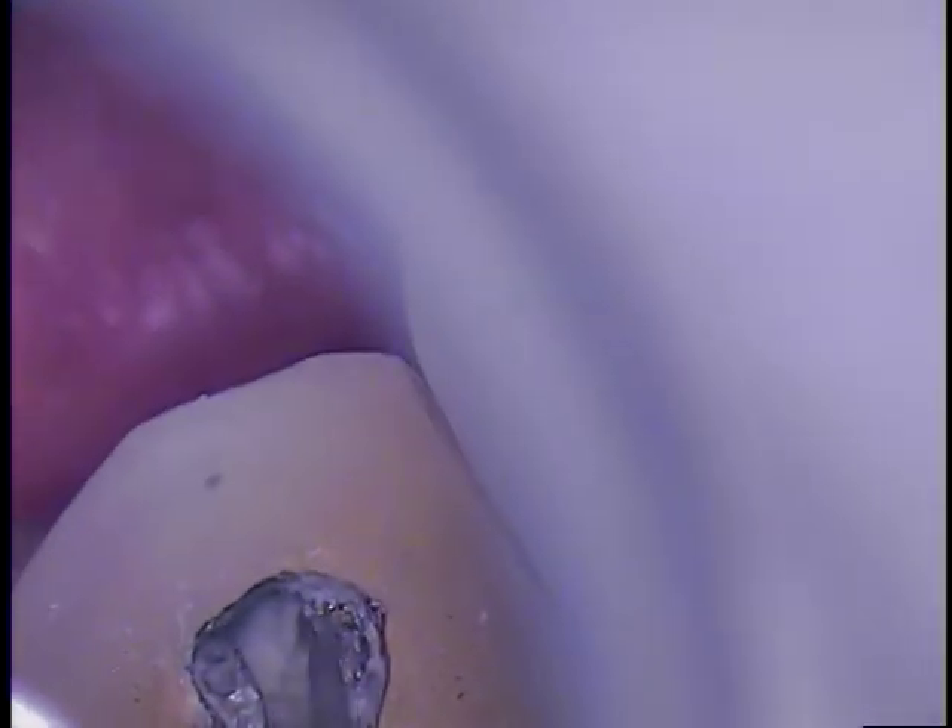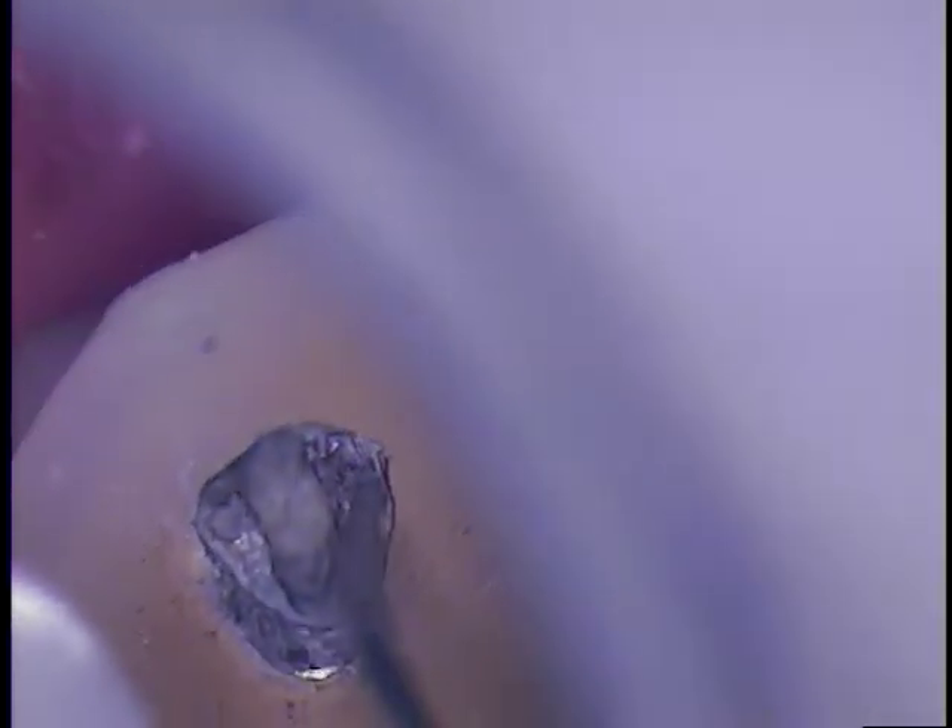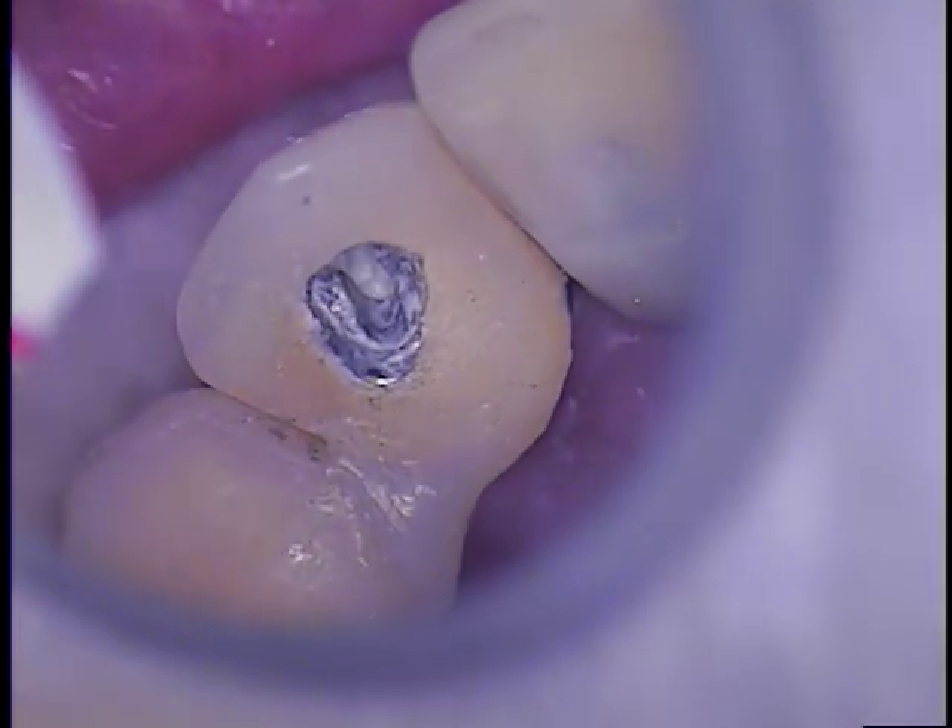Come on up here. I'll get in between the abutment and the crown and see if it wants to come loose. Well, we can always put the composite back — that takes two minutes — so I'm going to take the composite off. Probably as soon as I do that, this crown will pop off. We'll pick it up on another segment. Hopefully we'll have something more to show you when I come back.